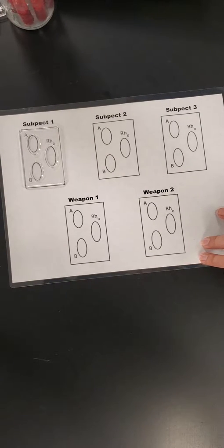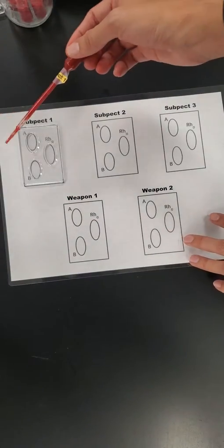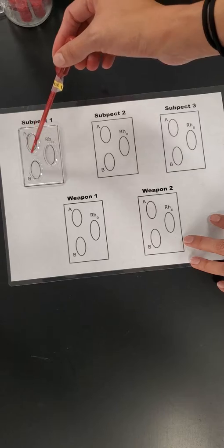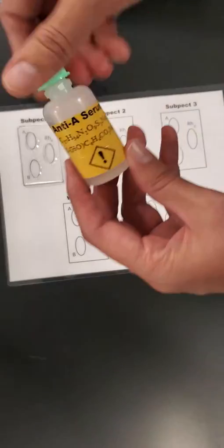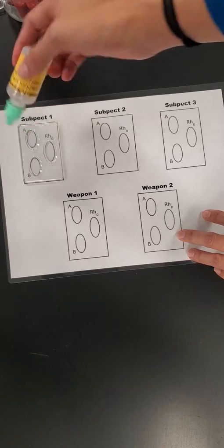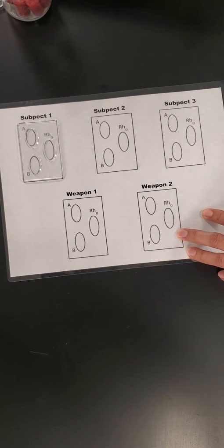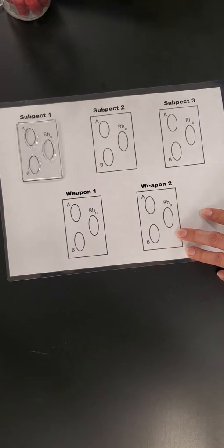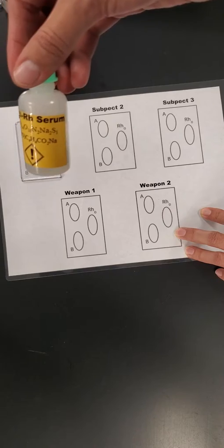Now what you're going to be doing, so let's say you're testing suspect 1, which in this case I believe is the orange color, you're going to be putting 5 drops in each one, and then you're going to be testing it with the right serum. So for example, this is serum A, and so you're going to be placing the drops there, and then you're going to observe to see if any agglutination happens, and then you're going to do the same thing with the anti-serum B, and then the same thing with the one for Rh.